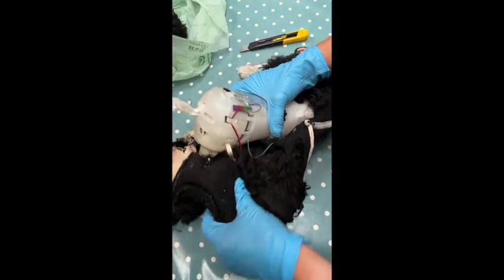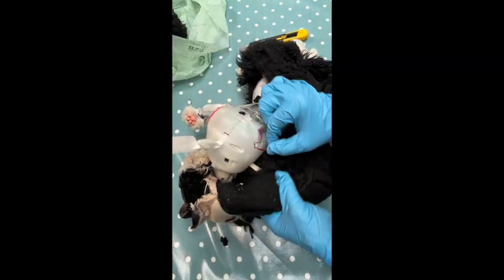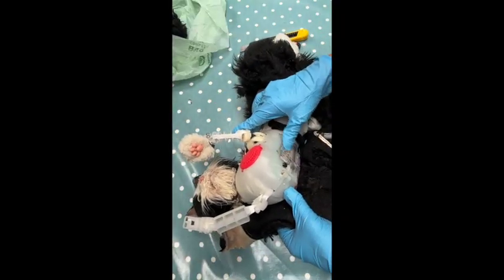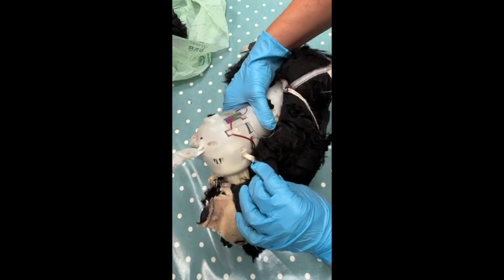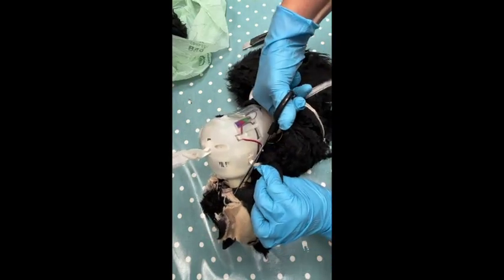That's the main bit of there. Oh, there we go. Another attachment here. Okay, and now we've got, yeah, I think you normally stroke the bottom, so that must be a contact point sensor under there. So it's fur fixing here. Cut that one off.